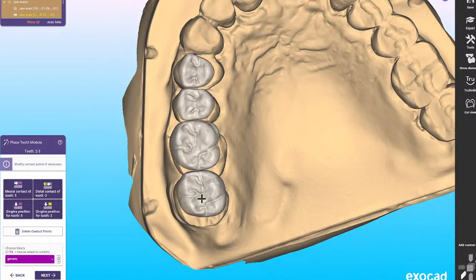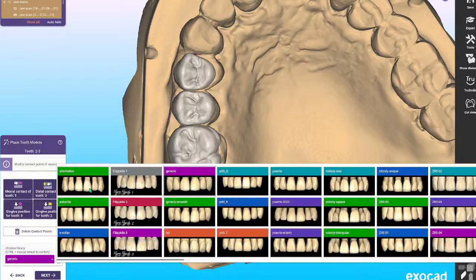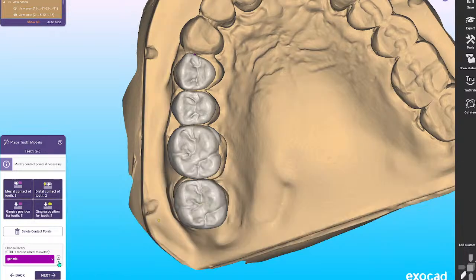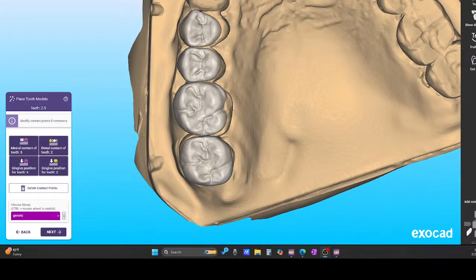And then once you do that, see it's gonna move. I like to go and change the type of the tooth selection. So in here you have all this. I just like to go right here in this dot over here. You can't see. Let me bring this up. Oh, why is this not moving? Just change it so y'all can see this.